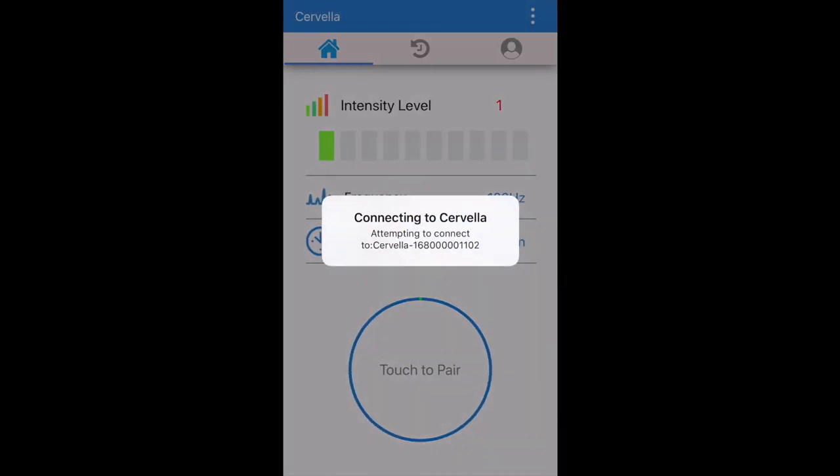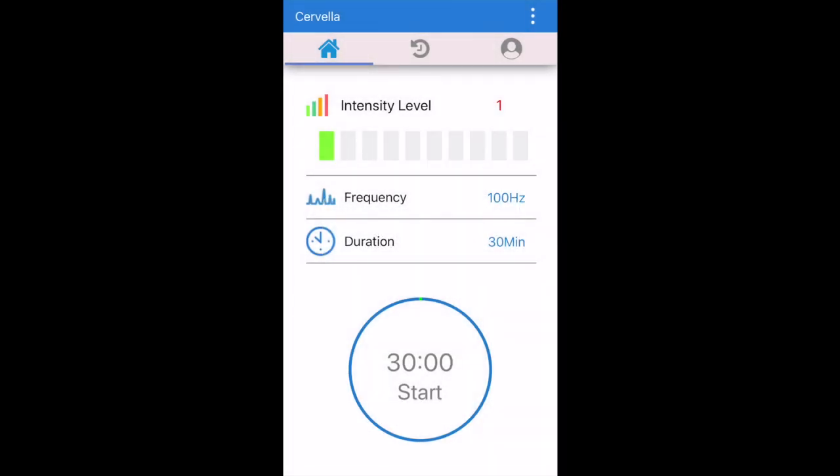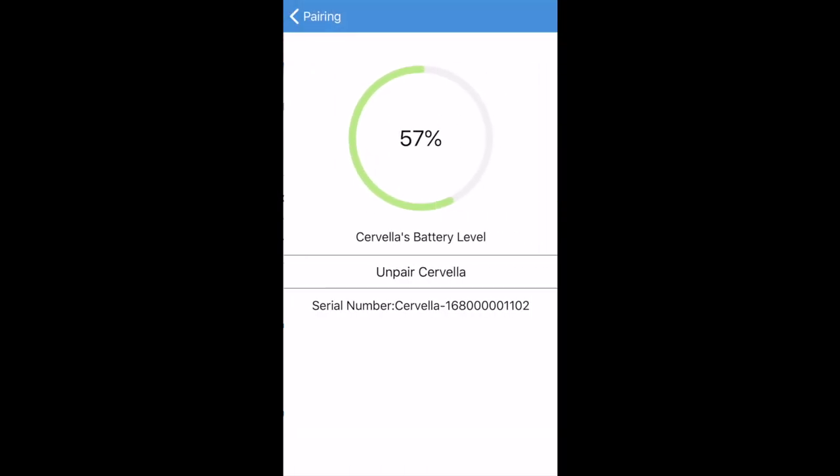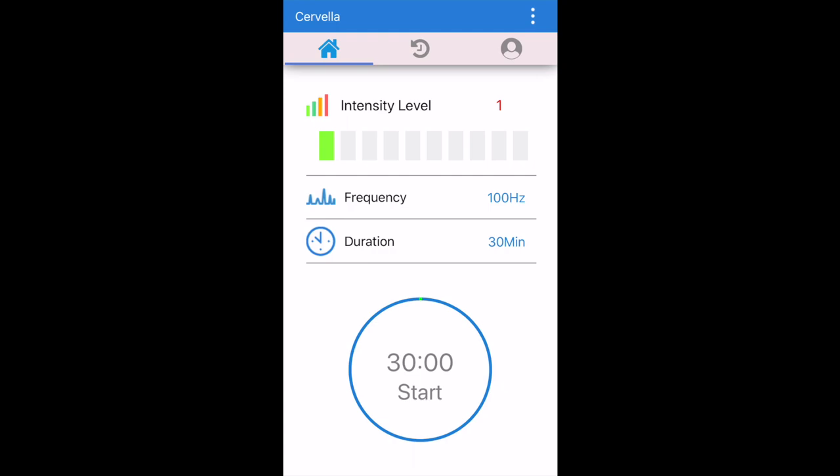If your Cervella is nearby and charged, it should appear in the list below. If you do not see your Cervella, press search again and wait a few seconds, or quit the app completely and try again, ensuring that the device is in close proximity to your smart device and Bluetooth is enabled.